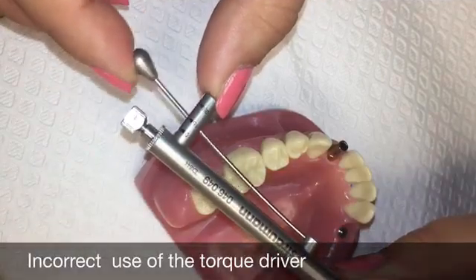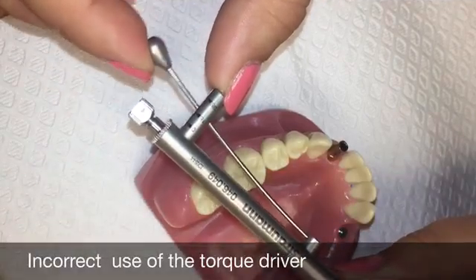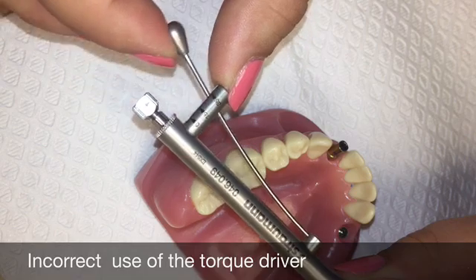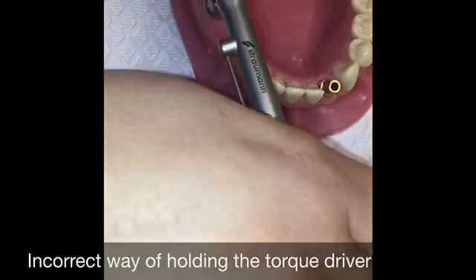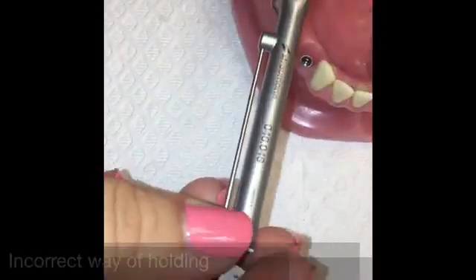This shows the incorrect use of the torque driver. This demonstrates an incorrect way of holding the torque driver.